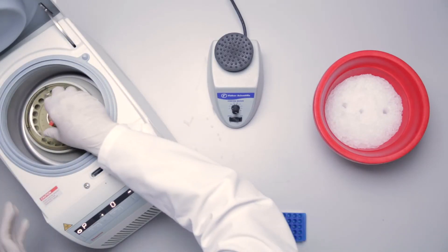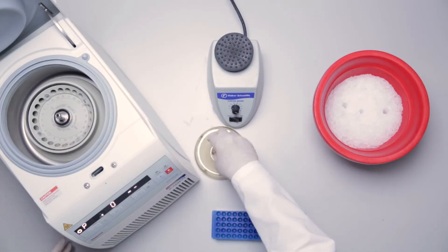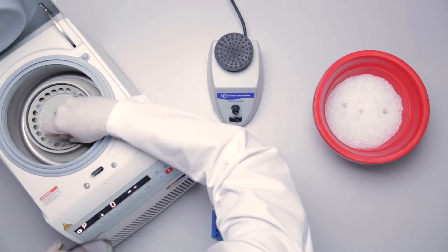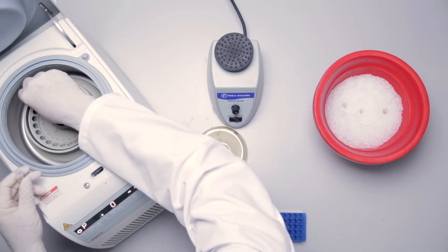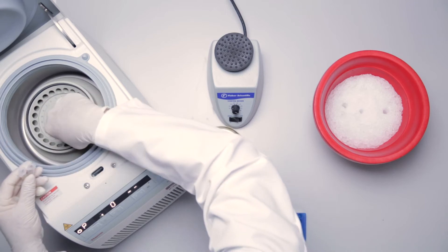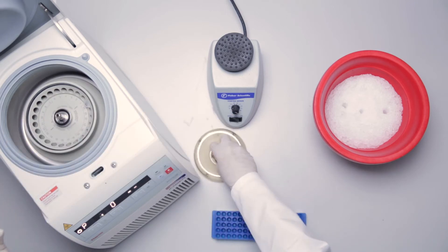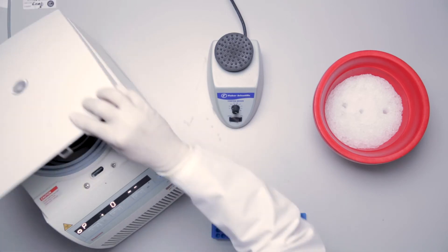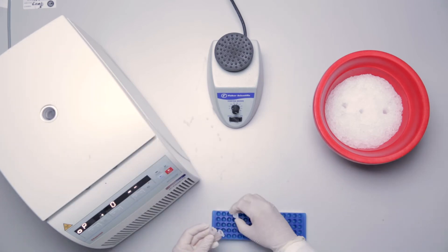If dilution is required, dilute serum or plasma samples in 1X universal assay buffer. For dilution of cell culture supernatant samples, use cell culture medium that was used to culture the cells. Be sure to note if there is a recommended sample pre-dilution factor so that it can be applied during the analysis step.